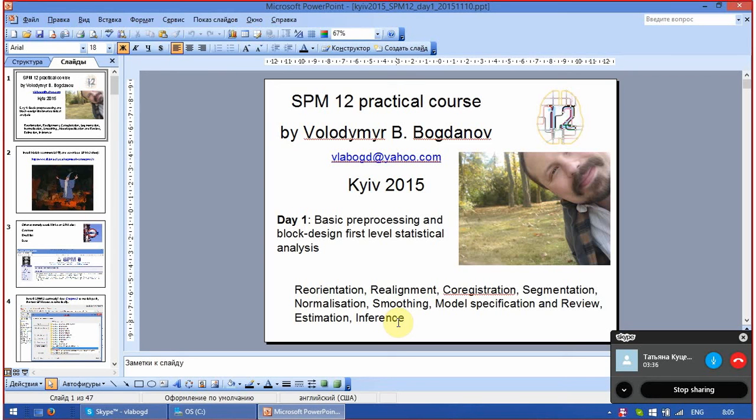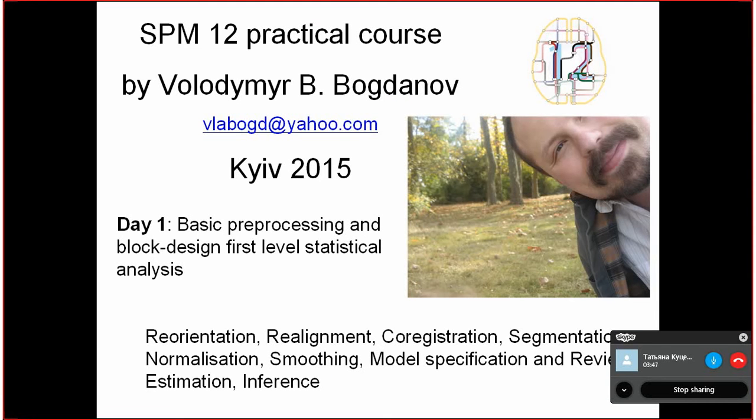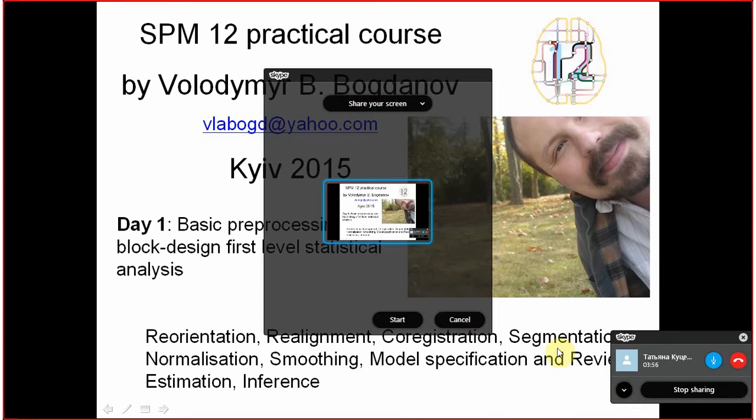We start a short 3-day practical course of SPM12. SPM is a piece of software dedicated for the analysis of neuroimaging data.